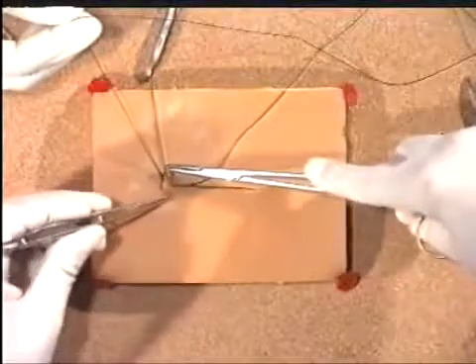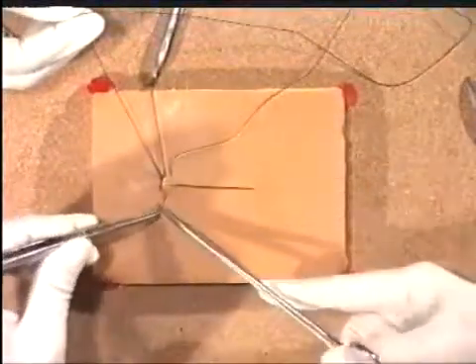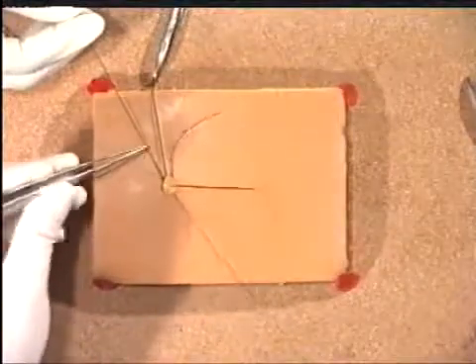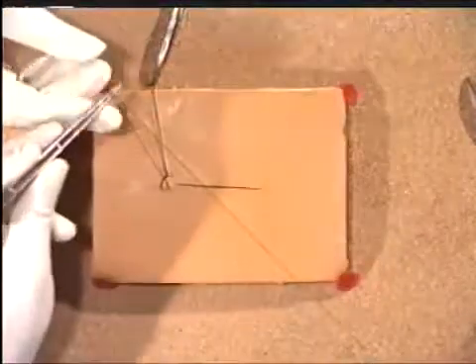Then continue suturing. As you insert the suture and pull it through gently, your assistant should release the suture and allow you to snug it down. Pass it again to the assistant.